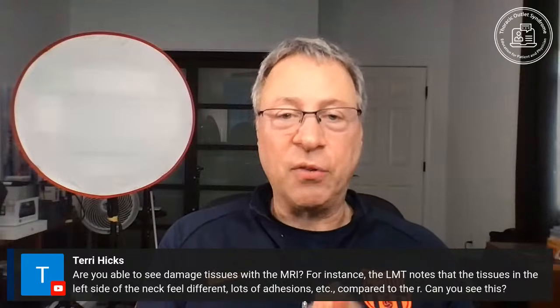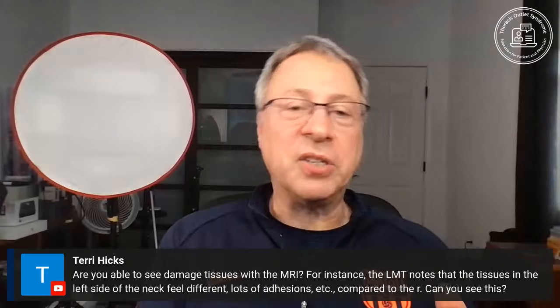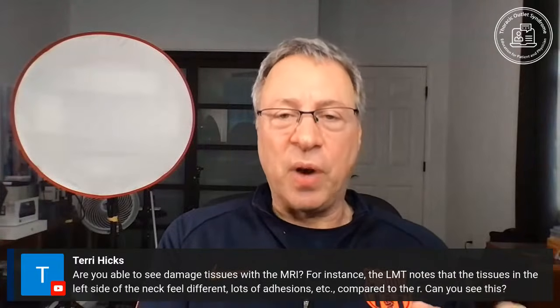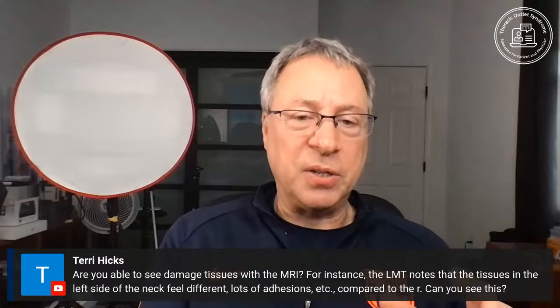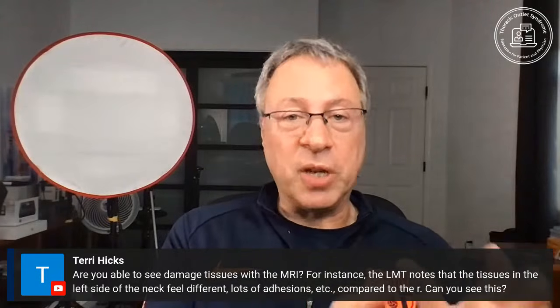Now, MRI doesn't have the resolution of electron microscopy, and it's not intended to do that. So we can't see the inner structure of a muscle, for example. But what we can see often is that the muscle is bigger in size, or maybe it's smaller in size. Sometimes with nerve damage, the muscles get very atrophic or small. The muscles can develop fat infiltrating into them rather than a normal healthy muscle.